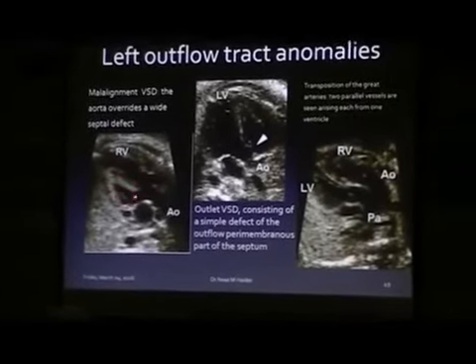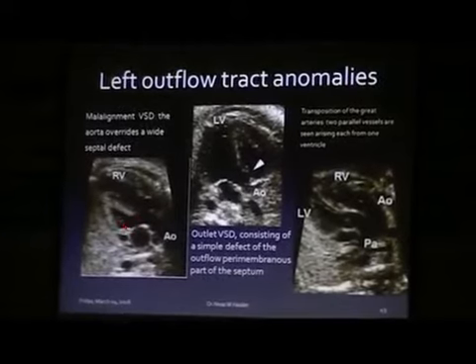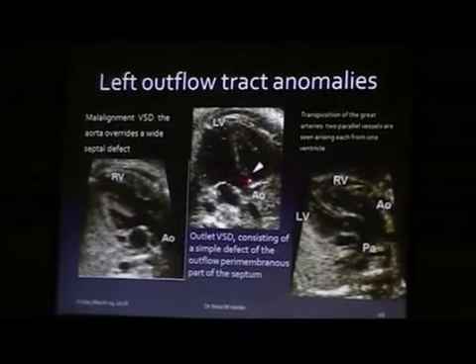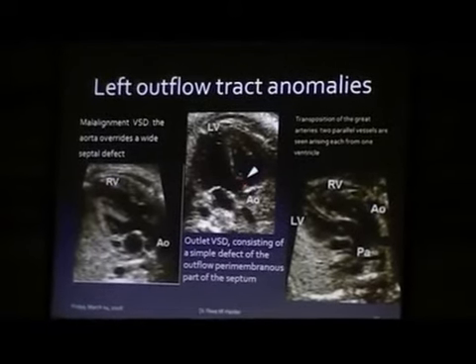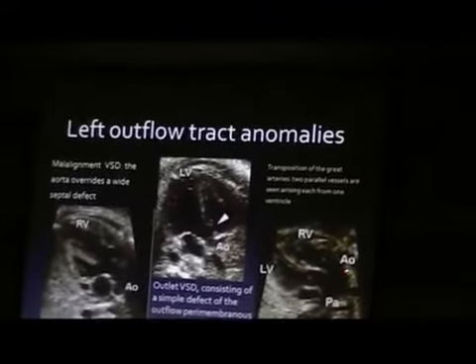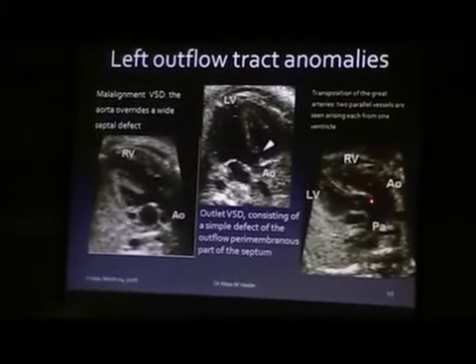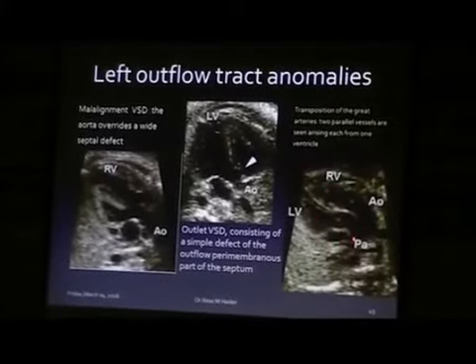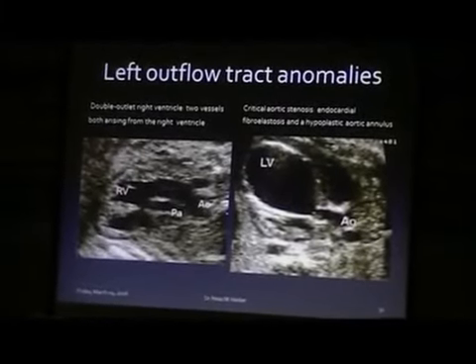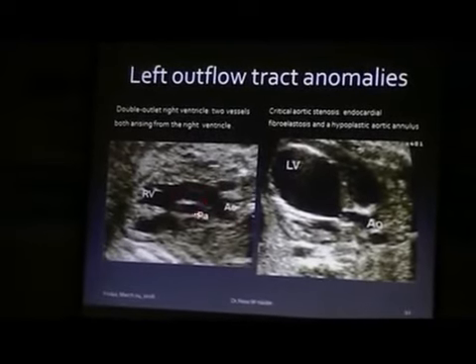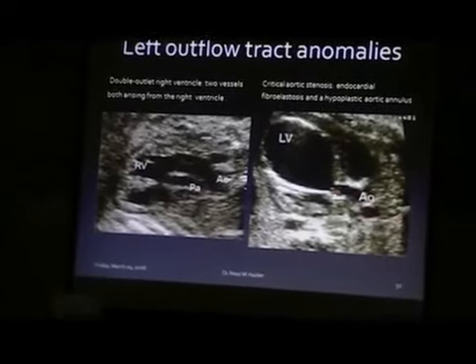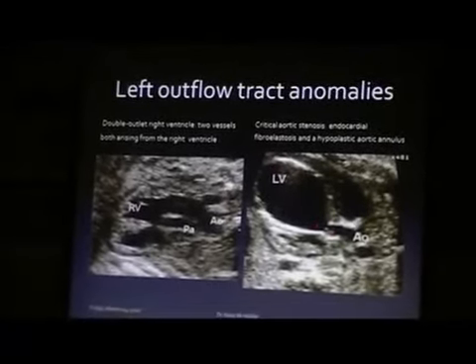This is the malalignment VSD with the fibrous ring, and the aorta overrides the defect. This is the outlet VSD consisting of a simple defect of the outflow perimembranous part of the septum. This is the transposition of the great arteries — aorta originates from the right ventricle and the pulmonary artery originates from the left ventricle. Here, both great arteries originate from the right ventricle. And here, critical aortic stenosis with marked fibroelastosis of the left ventricle.